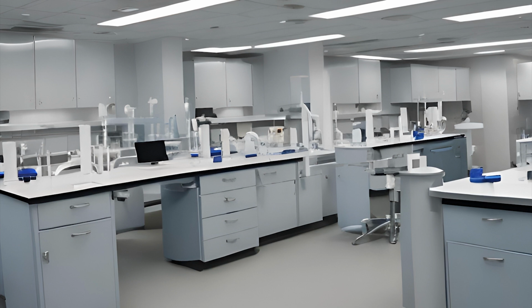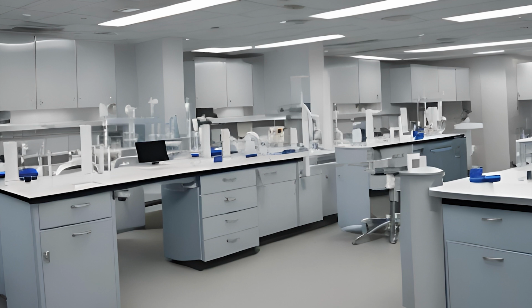Other causes of rejection, aside from the ones already spoken of, can include lipemia, or if your sample is clotted for a coagulation or a plasma sample, or if you've got a hemolyzed sample, which is where your RBCs get destroyed, and you can see the hemoglobin will stain the plasma or the serum a reddish color. The worse the hemolysis, the darker red. The worst I've ever seen was on a person who was having in vivo, which means in the body, hemolysis of their blood. Their blood was literally falling apart inside their own body.